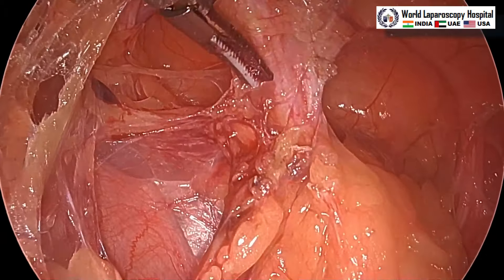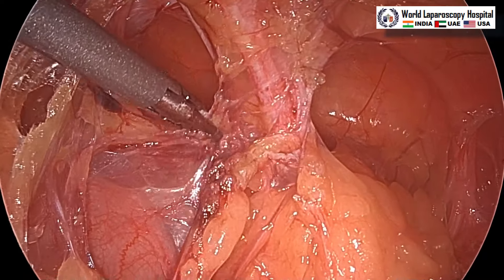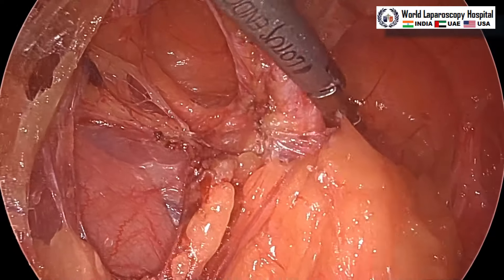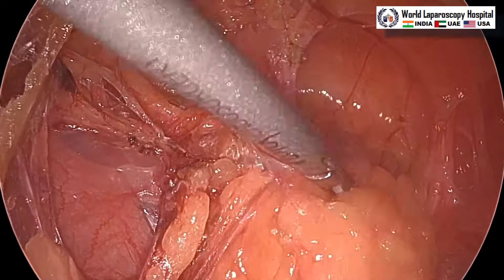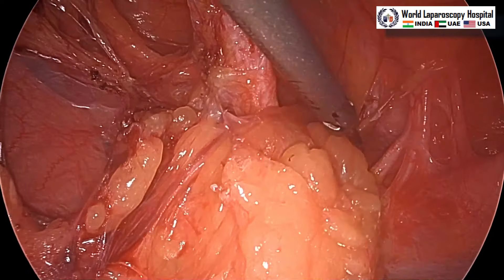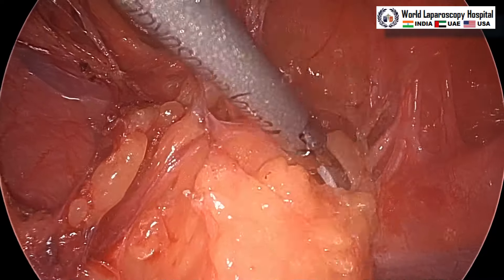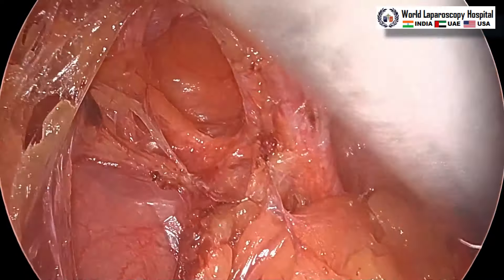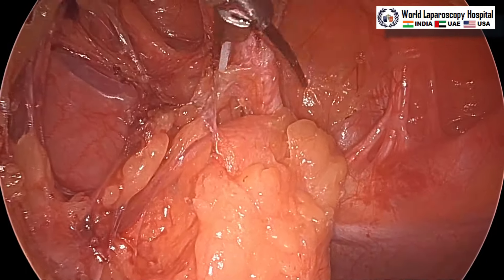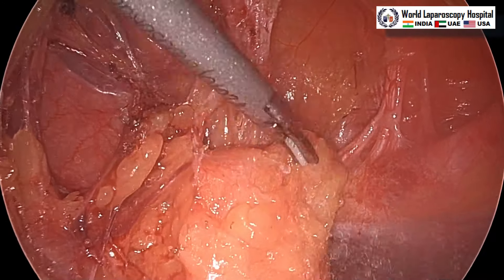These are the bridges we can see and we will never cut these bridges, because if you cut the bridge your support of the mesh will decrease. If it is present then fibrosis happens faster and it will be a better IPOM because we are not using IPOM Plus here. Swiss cheese hernia has this advantage — multiple small hernias have better outcomes in laparoscopy compared to one big hernia. These are very strong bridges in between and multiple small hernias are present.